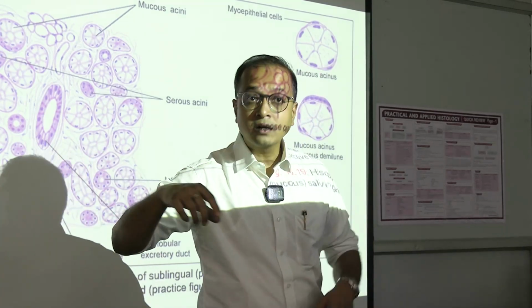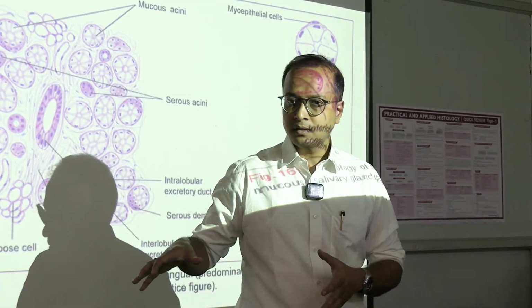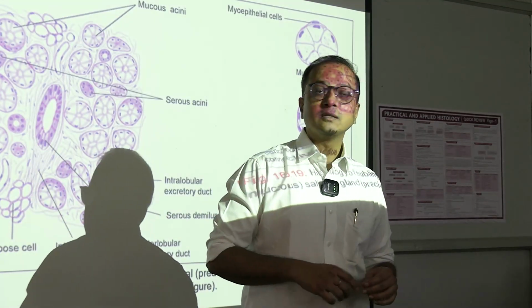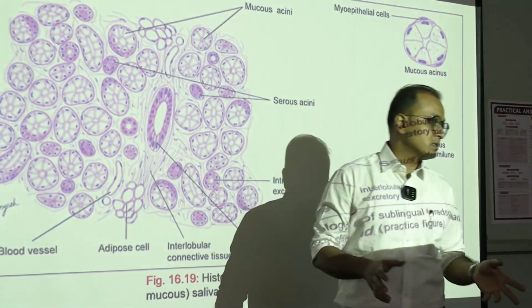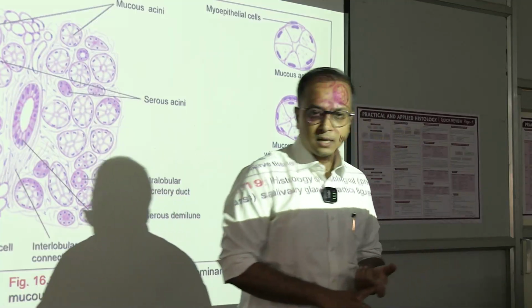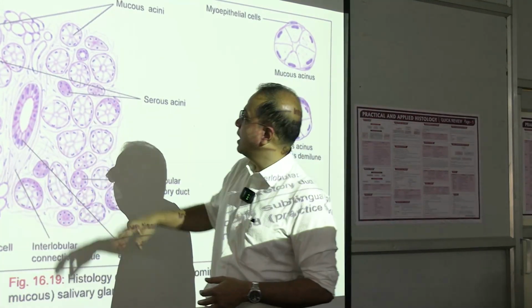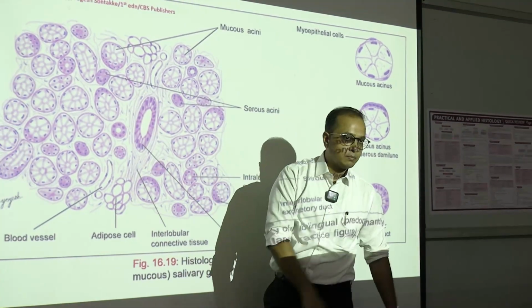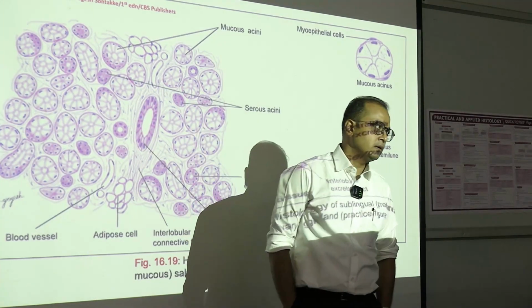If you see a duct outside these lobules, it is interlobular, and so on. Understand? Concept is clear. If you see something that doesn't look like these ducts, something else, it could be blood vessels, it could be fat tissue. That means connective tissue. Blood is a connective tissue, blood vessels too. So, the same thing falls here. We have the lobes separated out, and between them we have partitions, septa, septations, and everything is present in it. That is how we are going to understand these concepts.